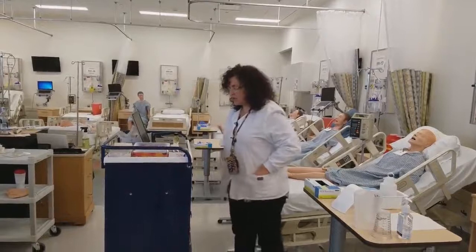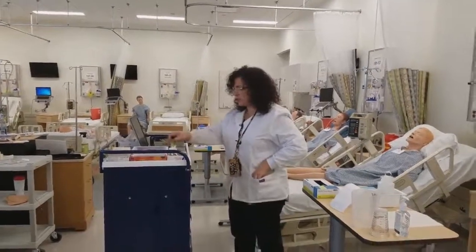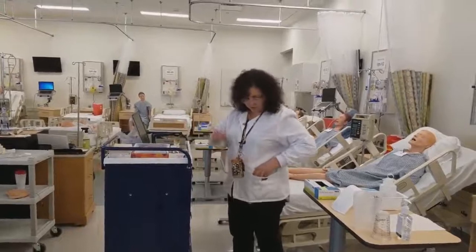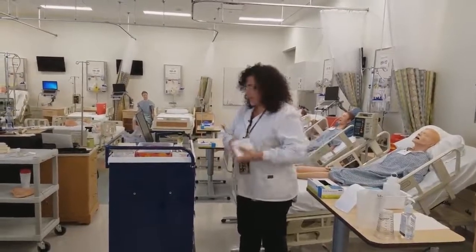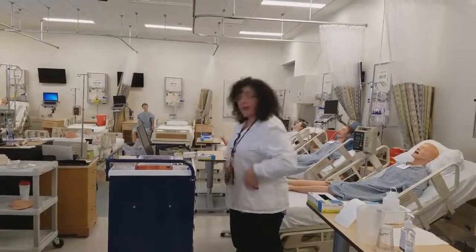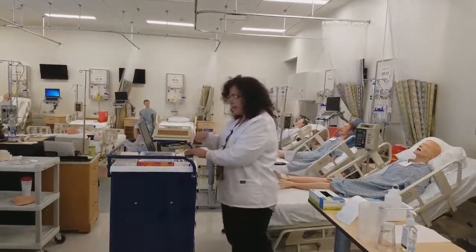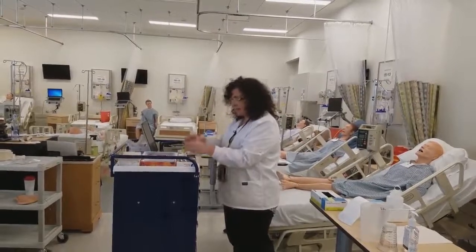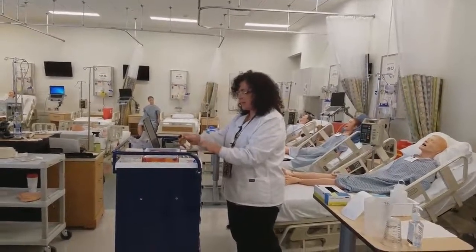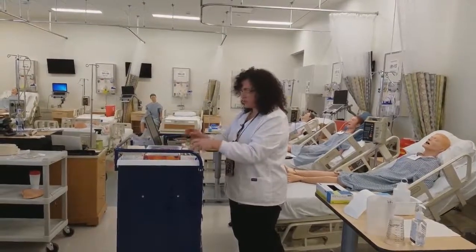I will need to do some med math as well, because I have to determine how much of this oral solution I will need. If I need a volume that is less than 10, I will need an oral syringe. So I would calculate my med math. In this instance, I need a volume of 30 milliliters, so no need for an oral syringe.